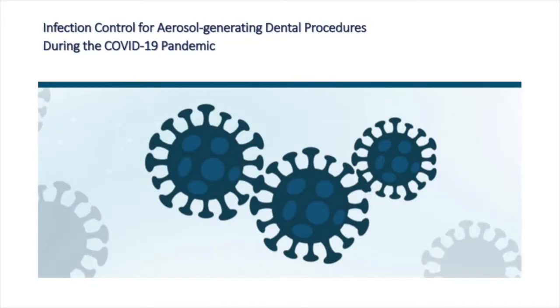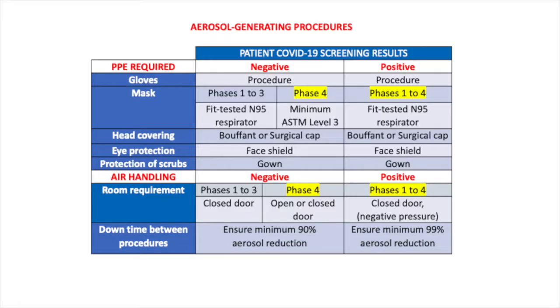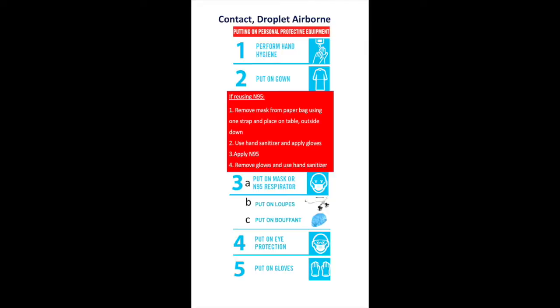Infection control for aerosol-generating dental procedures during the COVID-19 pandemic. Please note that the PPE used will depend on the current phase of the pandemic. Precautions requiring a reused N95 respirator and a closed room are presented here. However, sequences for donning and doffing of PPE and the instructions for their reuse apply regardless of the nature of the procedure being performed or the PPE used.